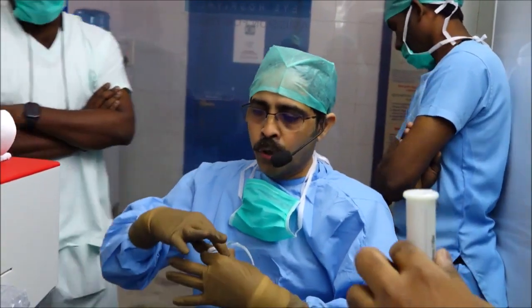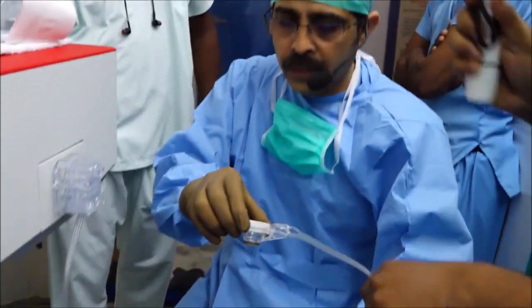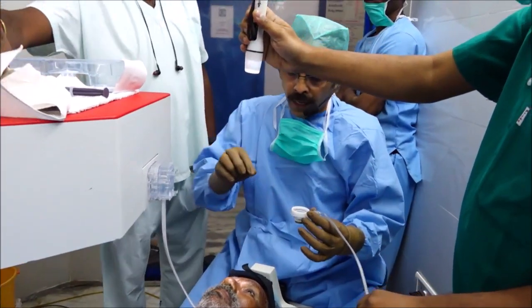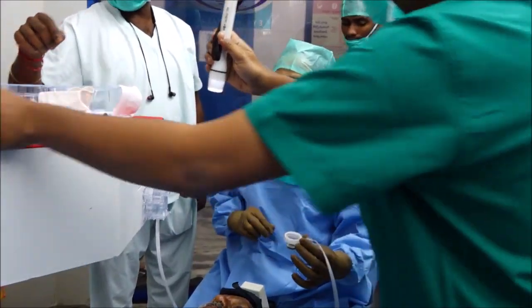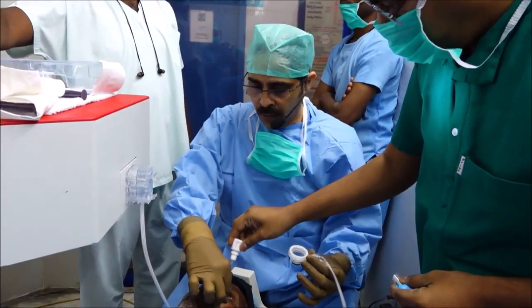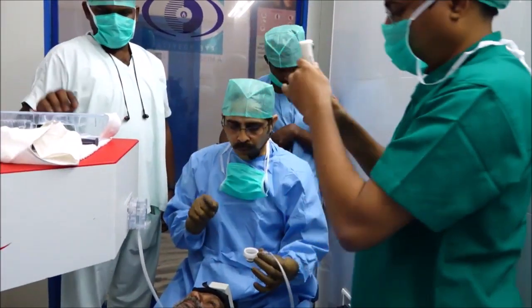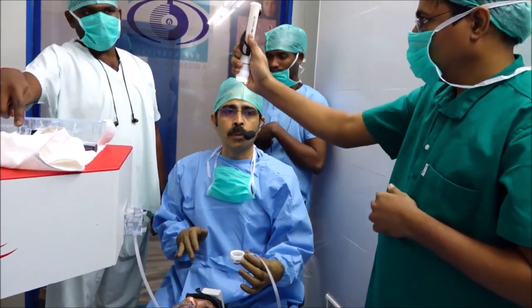Now I am going to start the exact procedure. The patient is well prepared. We just put a little bit of proparacaine drops so that the eye will not be painful. We did not give a block — we don't need to. In the initial days I used to give a block for this procedure, but I stopped because sometimes a block causes conjunctival chemosis.